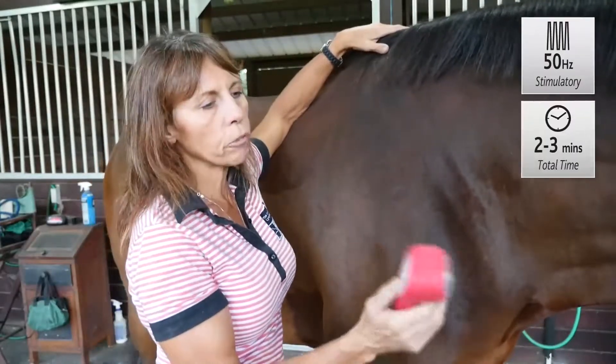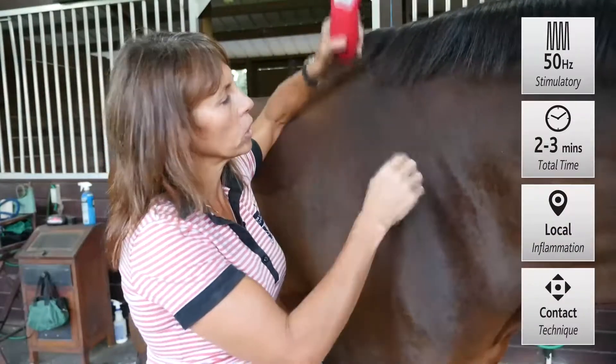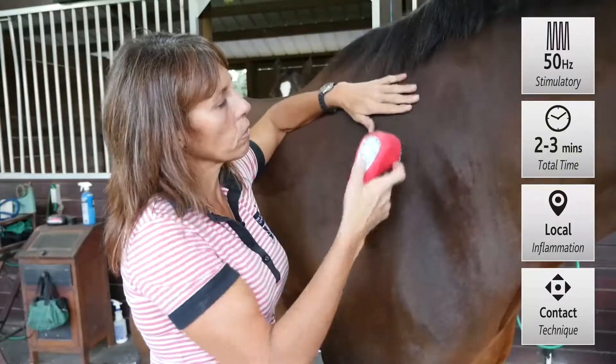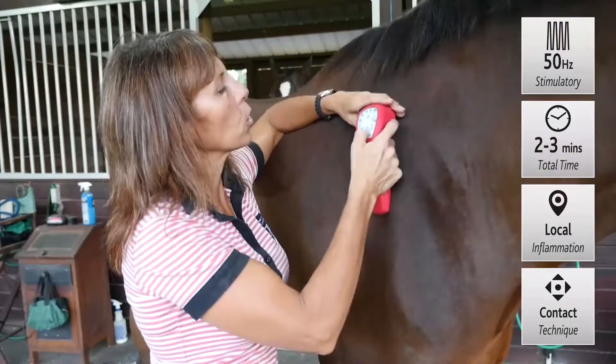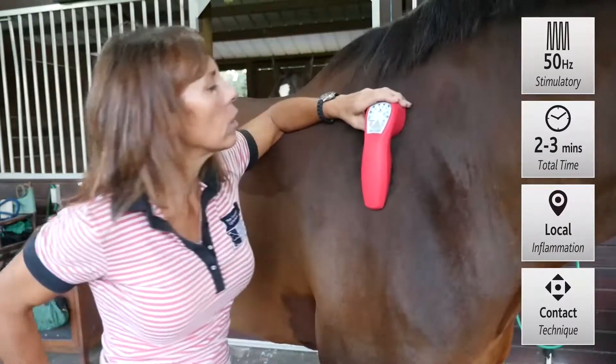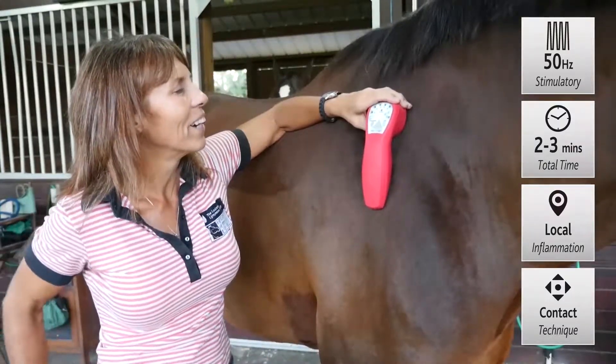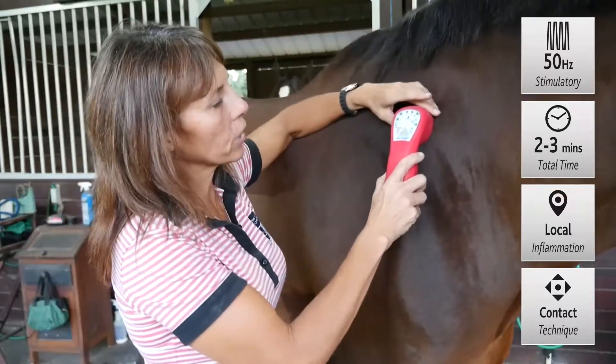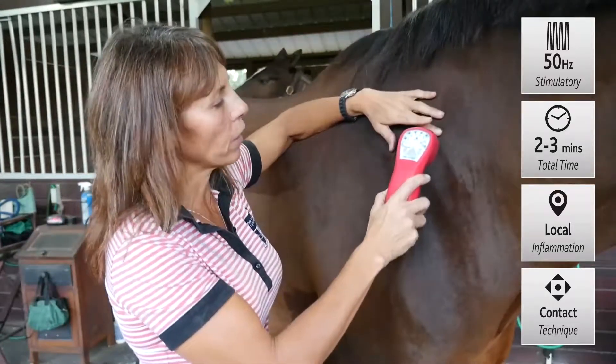In this area, we want to treat for nerve irritation and nerve inflammation. The suprascapular nerve comes out the front of the cranial border of the scapula, so you would get your anatomy book and find that direct area of treatment, then apply your laser directly over that area to reduce the inflammatory reaction there.